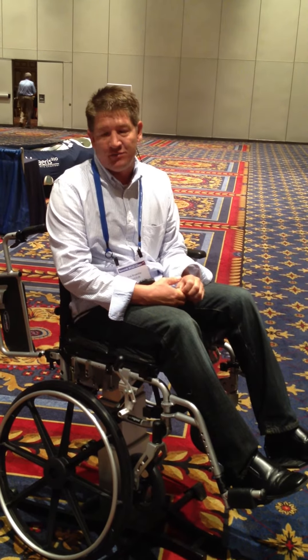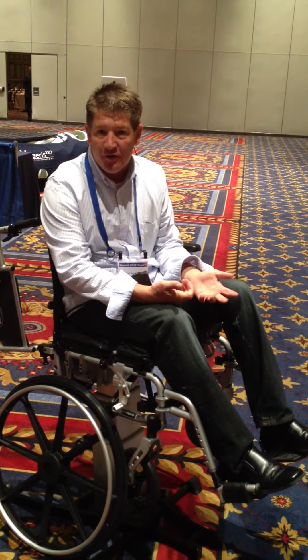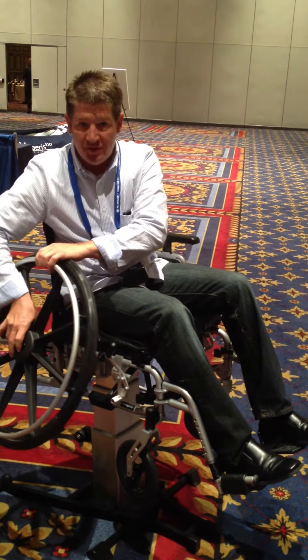Our daughter uses it and she's been using it for years, and now her job opportunities are open to her. She cooks her own meals at home, transfers herself into her bed, and at school she uses it for science lab or getting to her locker. So it truly is liberating the person in the chair.